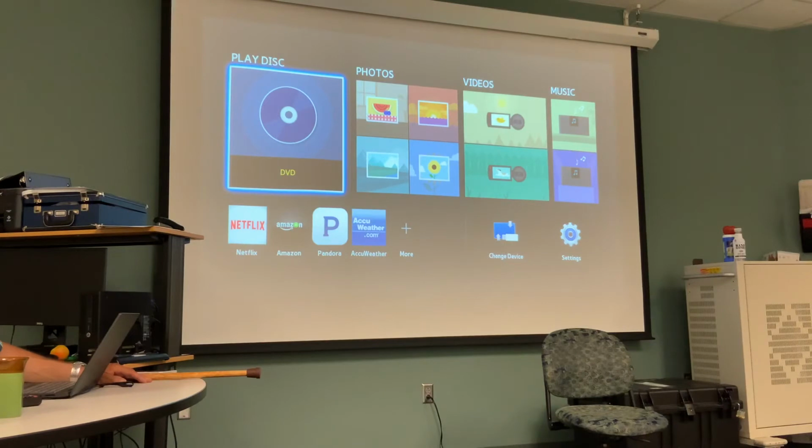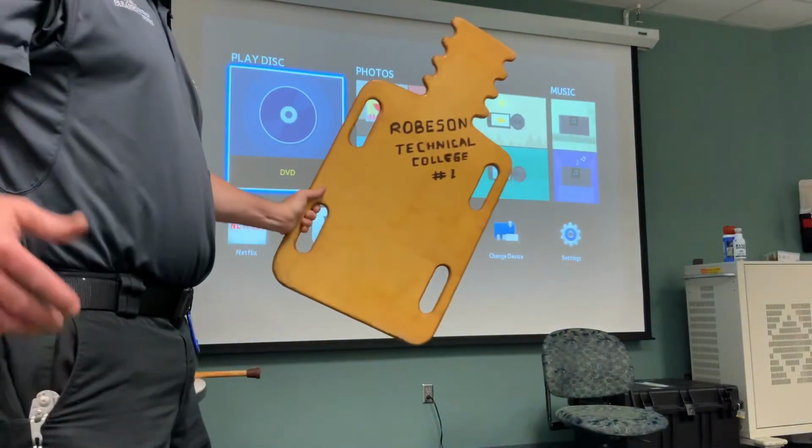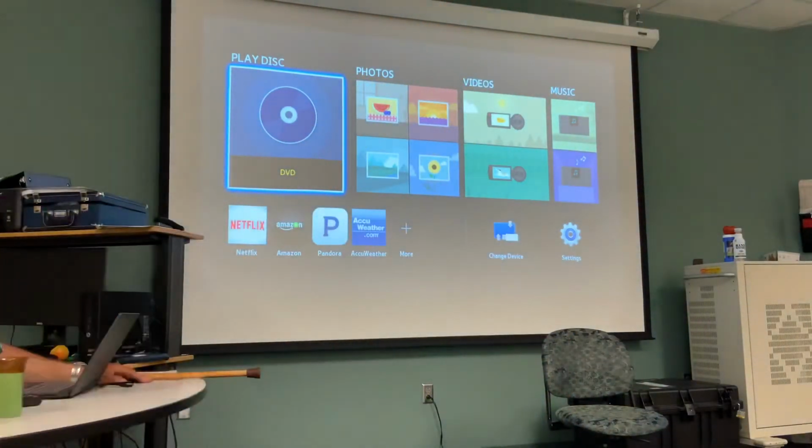That's a short board right there you put up under the chest to do CPR on. That's what they call a short board. All right? Yeah, show them. That's a short board. Short board kit. You see it? It gives you a hard surface when you're doing CPR.